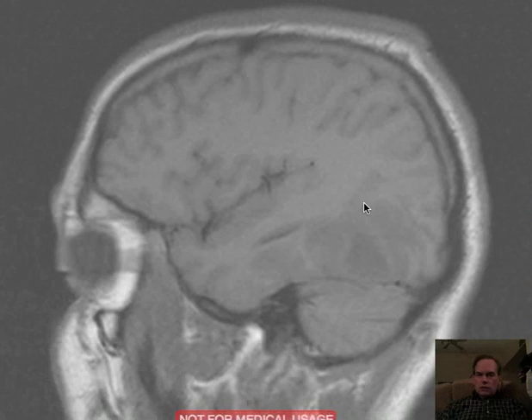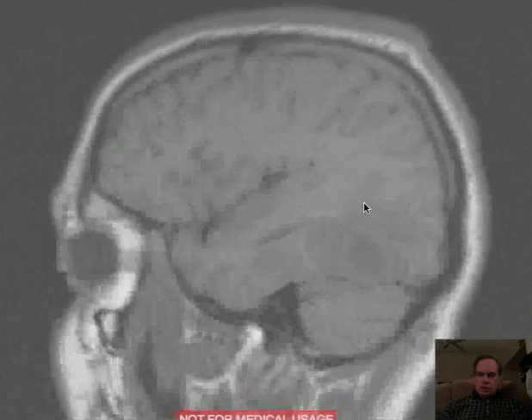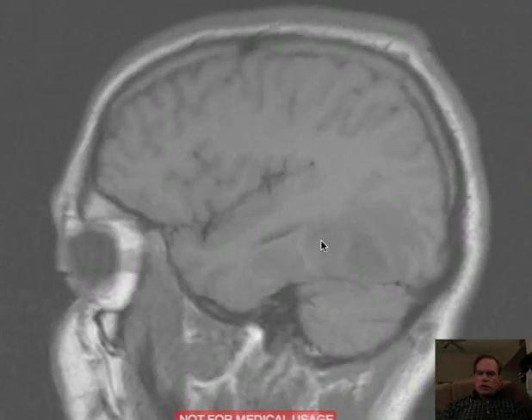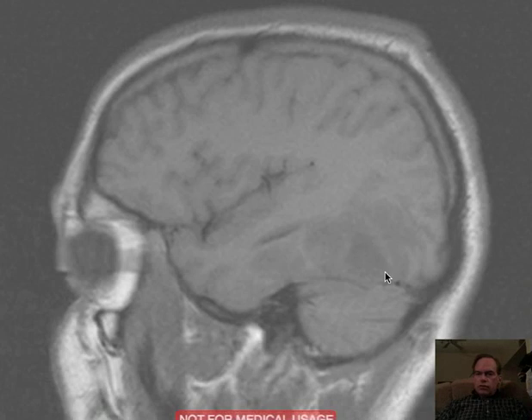This involves the occipital lobe and a little bit of posterior temporal lobe. You can see this heterogeneous area of low signal intensity, a portion of which appears relatively confluent and of fairly uniform low signal intensity, and the other portion is a little more heterogeneous.